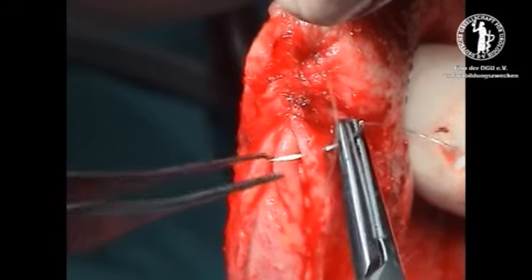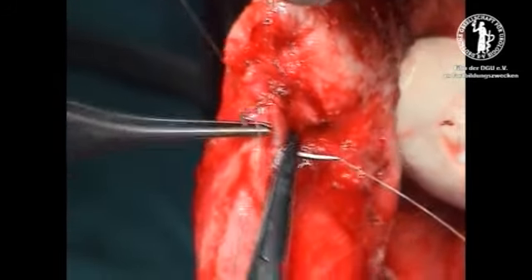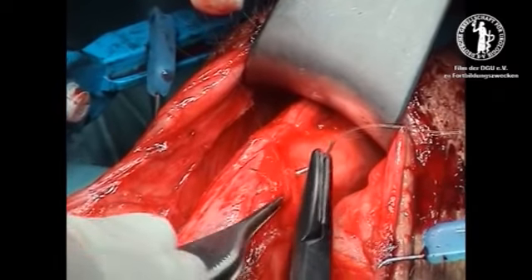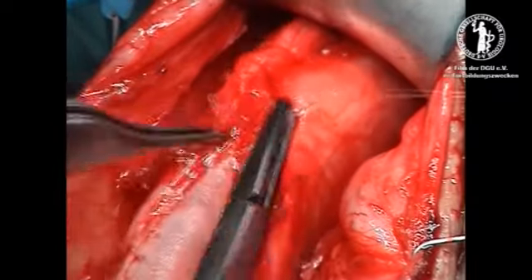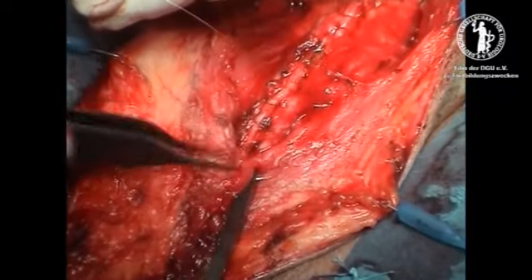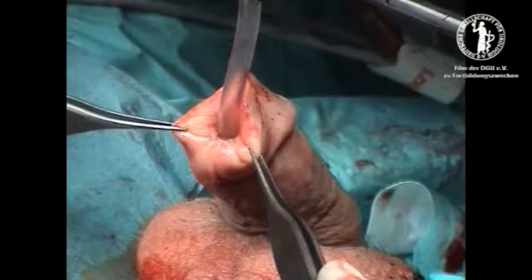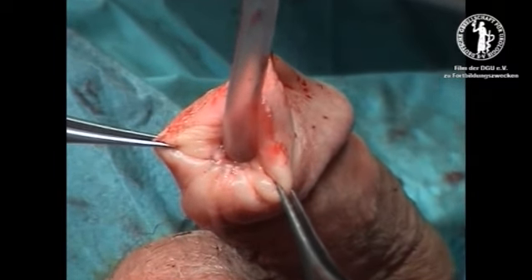The corpus spongiosum can be closed by 4-0 Monocryl, even in the penile part of the urethra, due to the urethrotomy performed some weeks before. A suprapubic tube and a single-use 20 French catheter is inserted for 3 and 1 week, respectively.